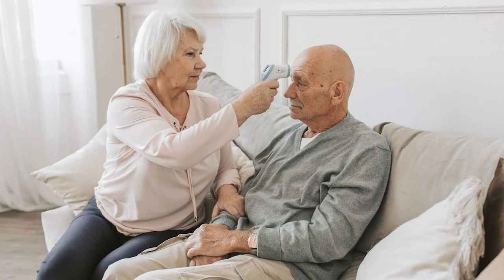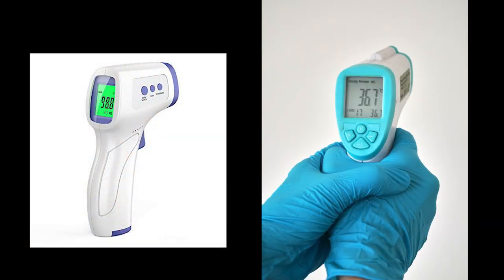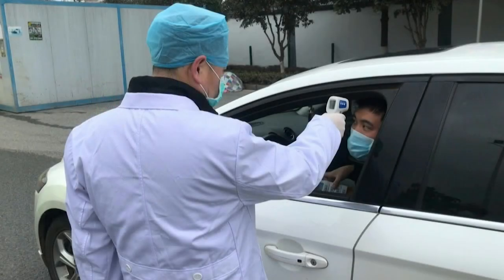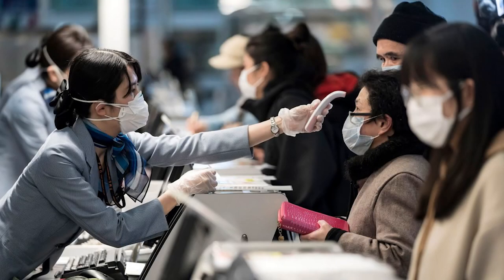The last type of thermometer has increased in popularity due to temperature screening checkpoints at most buildings and venues over 2020 and 2021 — the non-contact thermometer. Non-contact thermometers measure the infrared radiation emitted from the forehead or temple. These devices are quick, portable, and extremely clean for scanning multiple people without cleaning the device between scans. The downsides are that they read surface temperature and are inaccurate depending on the ambient temperature or if the person was wearing headwear.